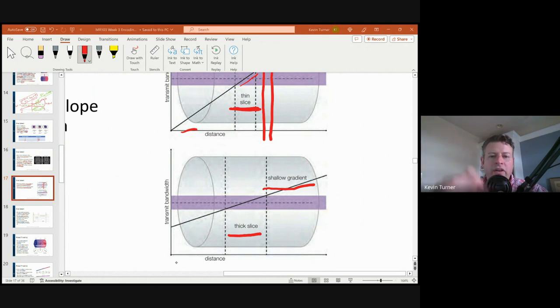So when you're on the computer, there's a thing that says slice thickness, like 2 millimeters. When you change that, you're telling the computer, when it scans the patient, what steepness of gradient to use. As I change that slice thickness number, when the scan gets run, that's going to determine what steepness of the gradient is used. What is the thinnest possible slice you can use? That depends on the strength of the gradients on your machine.